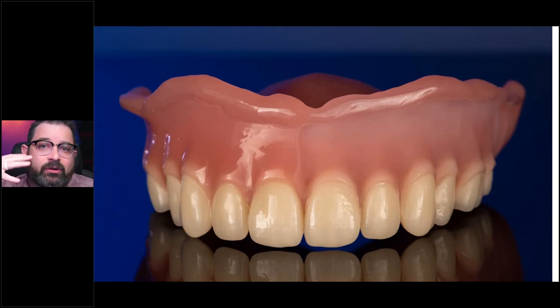The colors can be added either with composite, if you do a reduction. If you don't want to do any type of reduction and you're dealing with a monolithic restoration, or even a pink restoration, then you can utilize opticalized colors, and we'll talk about that in a minute.